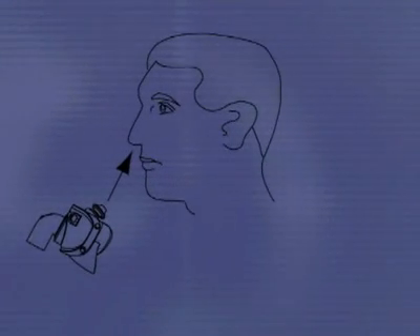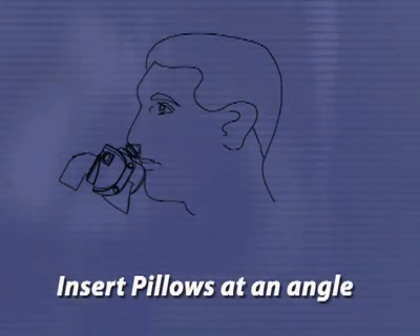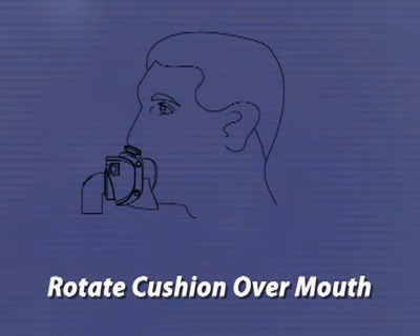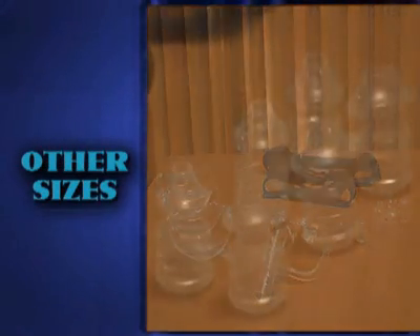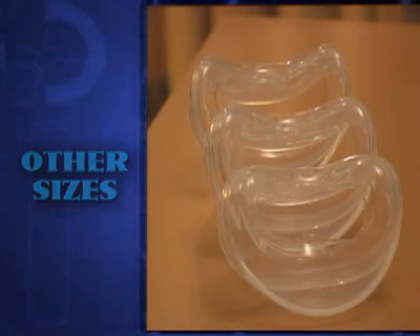If needed, you can reapply the interface by inserting the pillows at an angle into the nose and then rotating the oral cushion downward over the mouth. If you are unable to resolve leaks, you may need to try one of the alternative nasal pillow or oral cushion sizes included in your hybrid interface package.